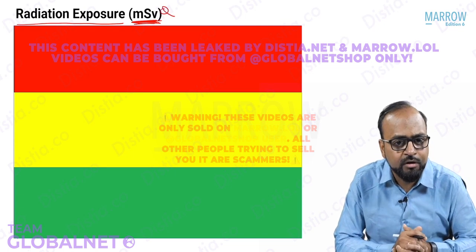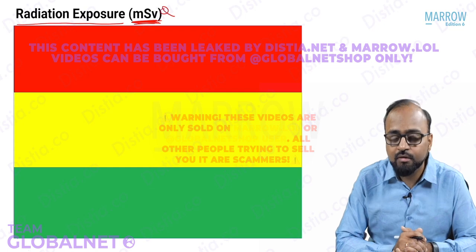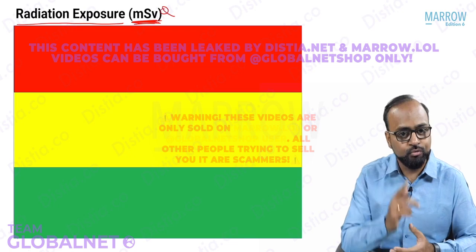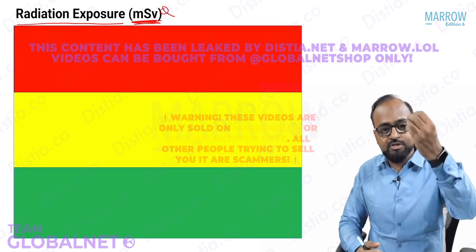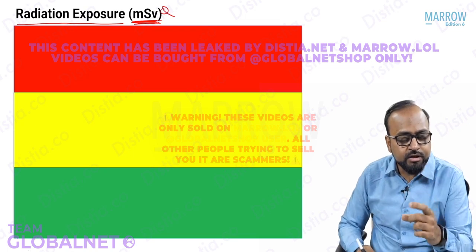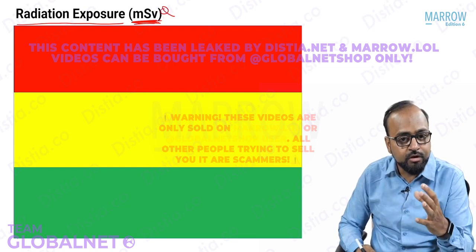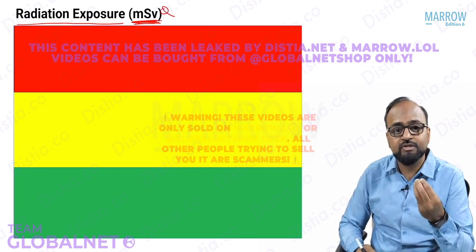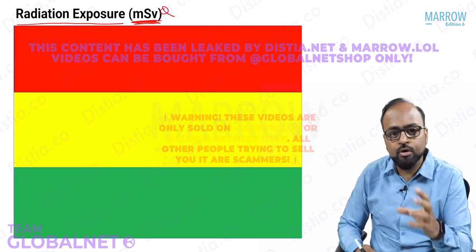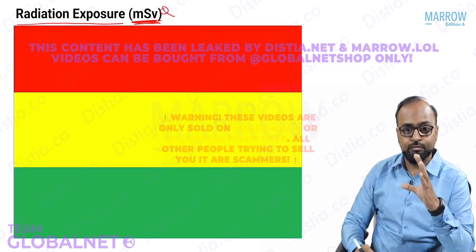So if you think about it, what modalities in radiology actually use colors? Color Doppler. What is the role of color in color Doppler ultrasound? Color tells us the direction of flow, important diagnostic information. Red is towards the probe, blue is away from the probe. Where else will you see colors? You'll see colors in PET scans and SPECT scan images, where the color map gives information about the metabolic status of the cells. Blue is low metabolism, red and yellow is high metabolism. So radiologists use colors when those colors give us some additional information.